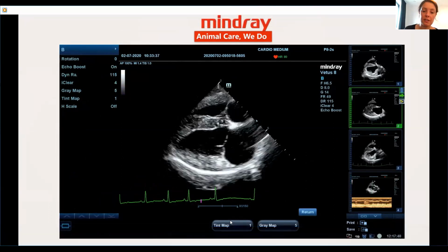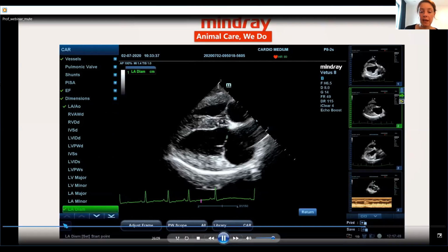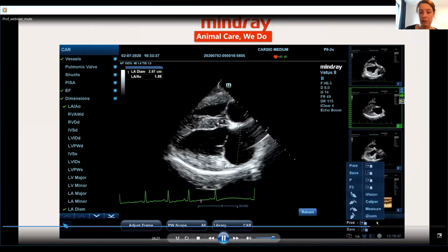Okay. Yeah, this is actually what I was talking about. You can measure the left atrial size compared to the aorta in the short axis view, but you can also measure a long axis atrial diameter. For that, we go back to our right parasternal 4-chamber view, and you see here the mitral valve annulus, and you try to draw a line through this. Then you try to stay perpendicular to this imaginary line through the mitral valve annulus. Then you orient yourself and measure from the interatrial septum, which is here, to the free wall of the atrium, which is here. And then you have the left atrial diameter in systole.